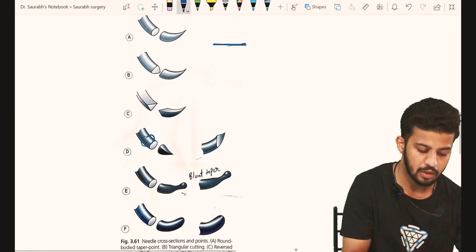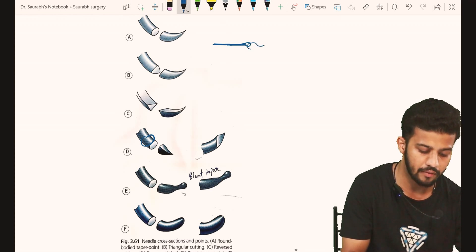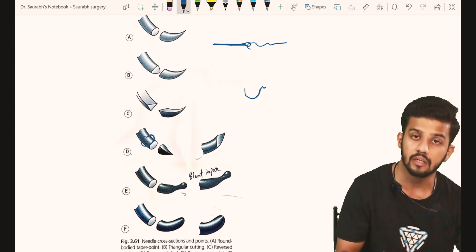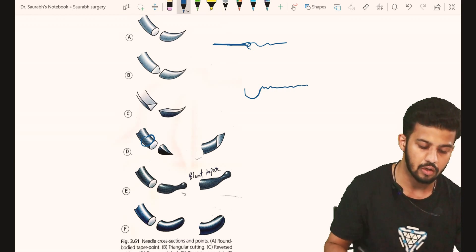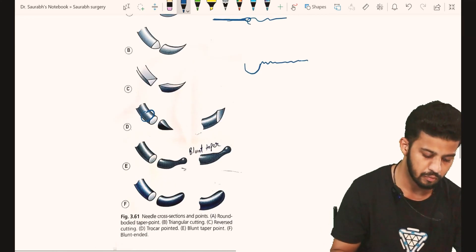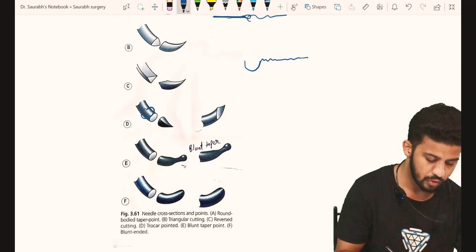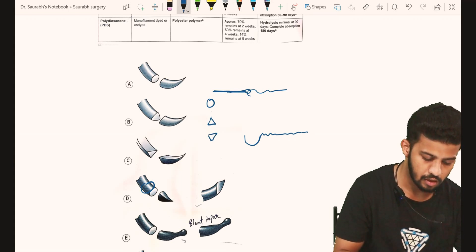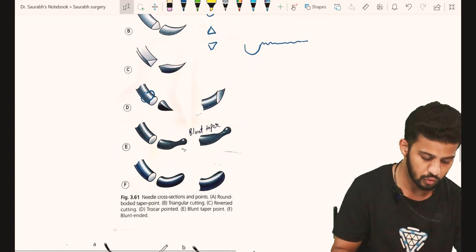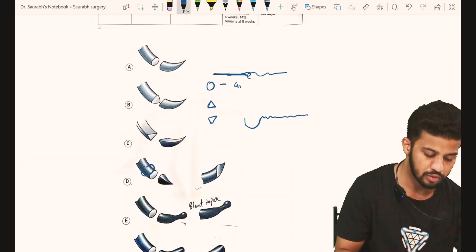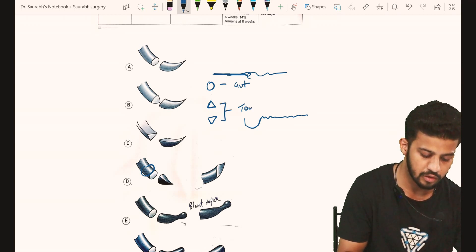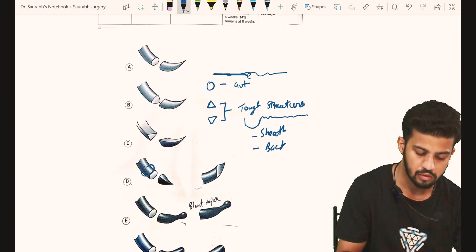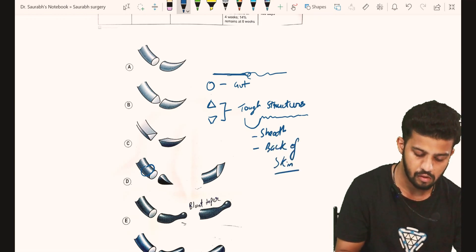Now, what kind of needles do we have? In the past, we used to have a straight needle with an eye, through which we would thread the suture. But nowadays we have pre-manufactured curved needles with sutures already attached, packed as disposable needles. Regarding cross-sections, we have three types: round body, cutting, and reverse cutting. Round body is mostly used in gut surgeries, while cutting and reverse cutting are used for tougher structures like fascia, the back of skin, and so on.